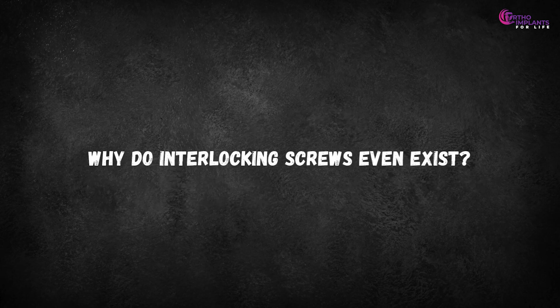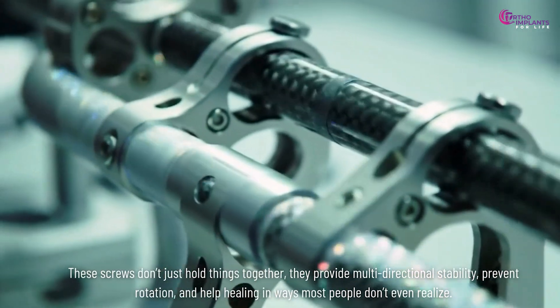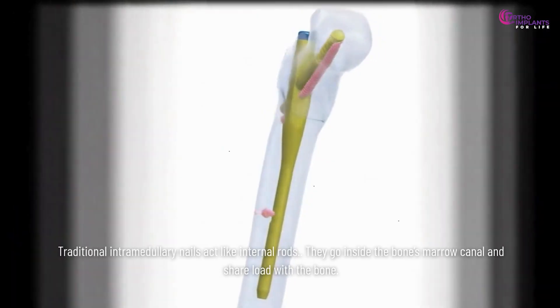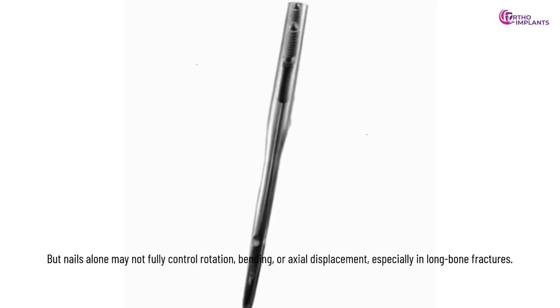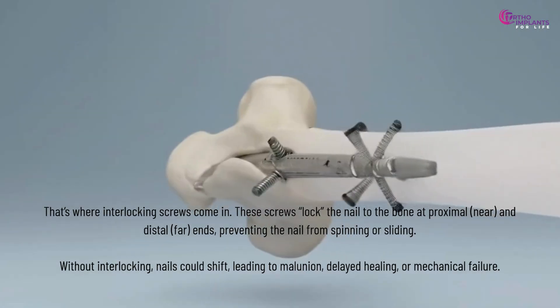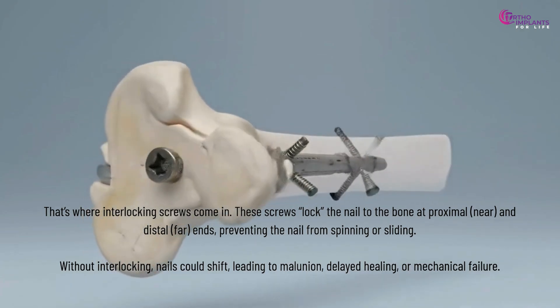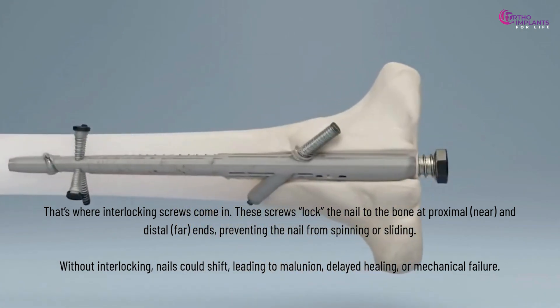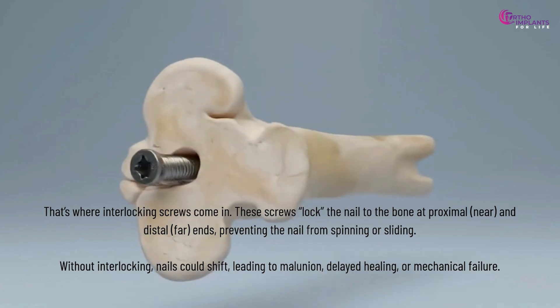Why do interlocking screws even exist? Traditional intramedullary nails act like internal rods — they go inside the bone's marrow canal and share load with the bone. But nails alone may not fully control rotation, bending, or axial displacement, especially in long bone fractures. That's where interlocking screws come in. These screws lock the nail to the bone at proximal and distal ends, preventing the nail from spinning or sliding. Without interlocking, nails could shift, leading to malunion, delayed healing, or mechanical failure.